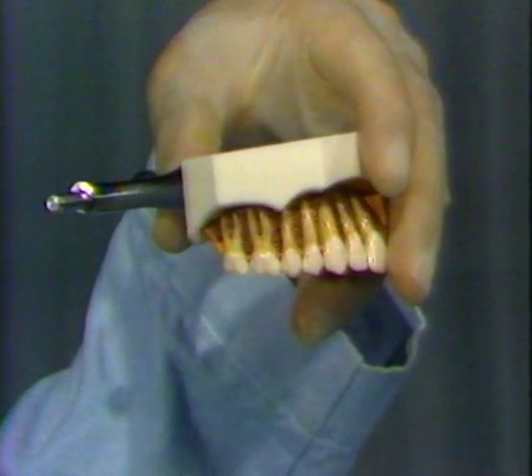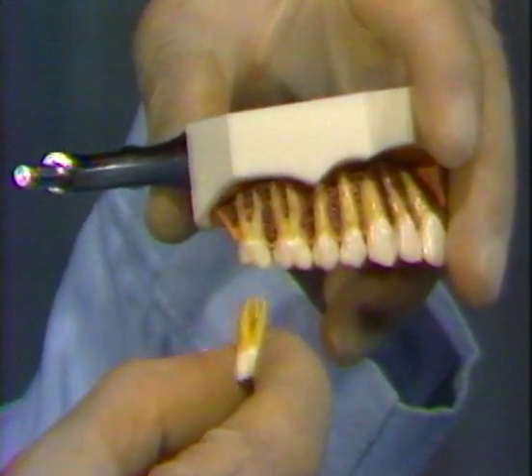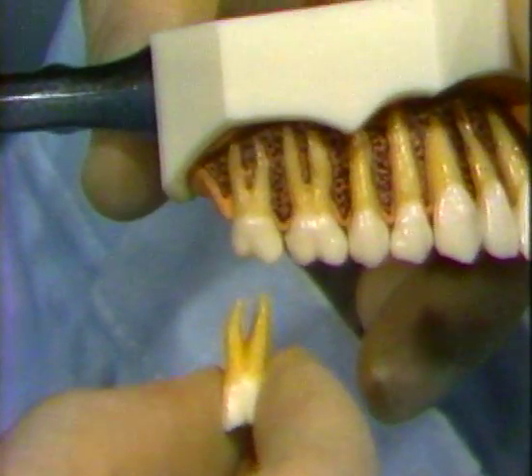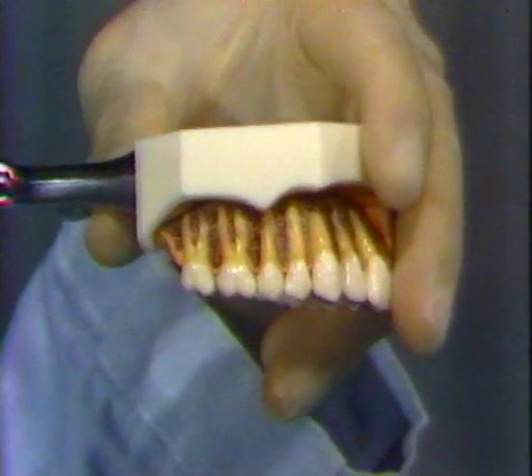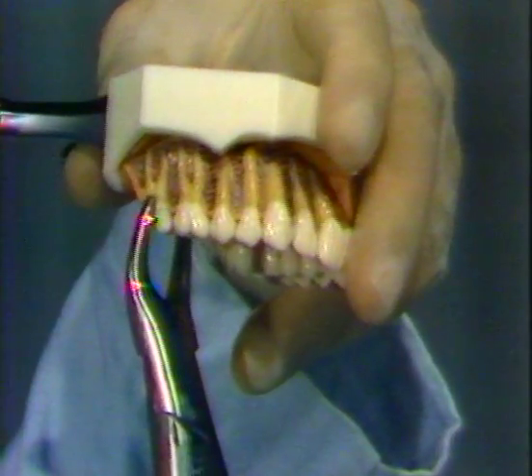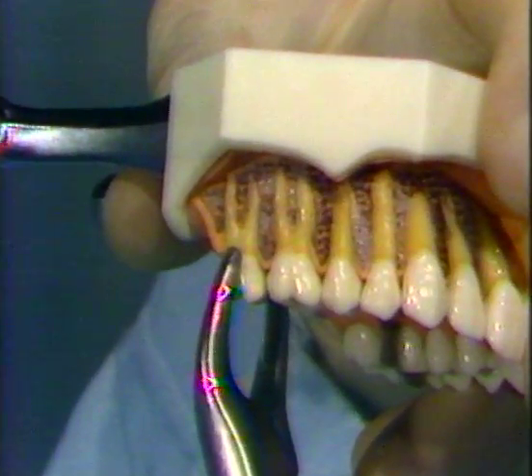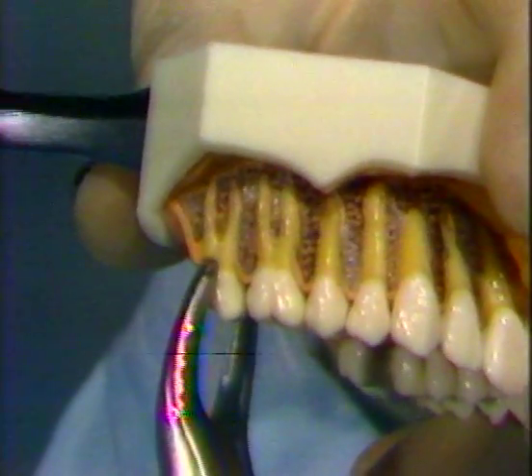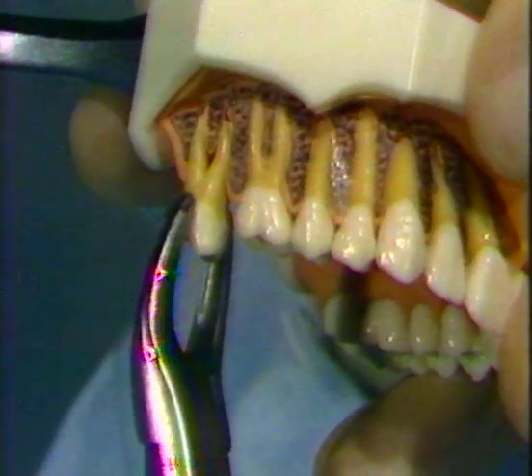The first tooth to be removed is the maxillary second molar. The second molar has 3 roots, 2 buccal and 1 palatal. With this in mind, apply the beaks of the forceps as previously described: the palatal beak first, and then the buccal beak, with the long axis of the beaks parallel to the long axis of the tooth. When the beaks are properly seated, grasp the forceps firmly at the end of the handle and push toward the root apex in order to establish a firm grip on the tooth.